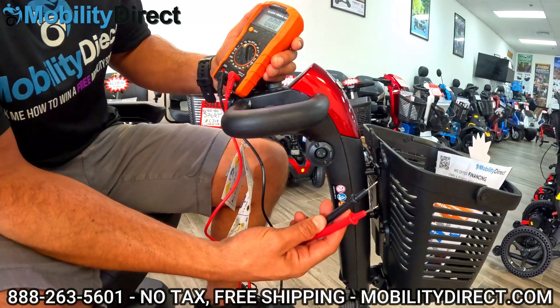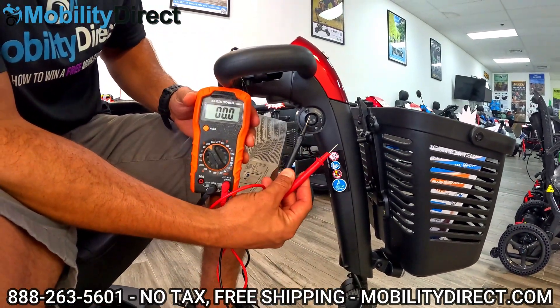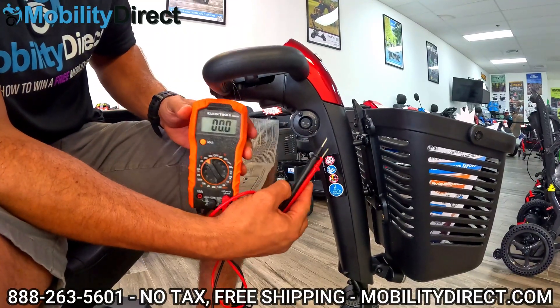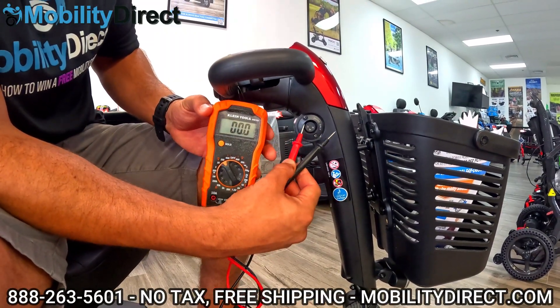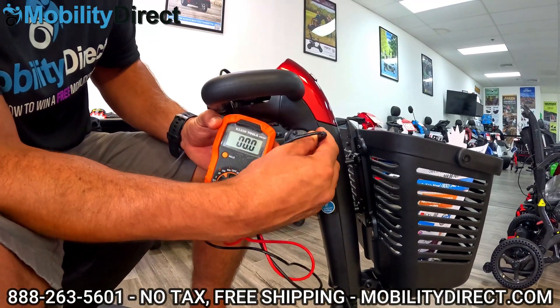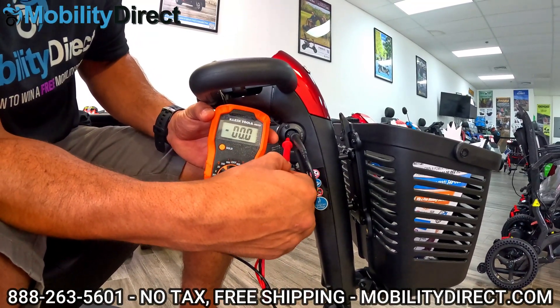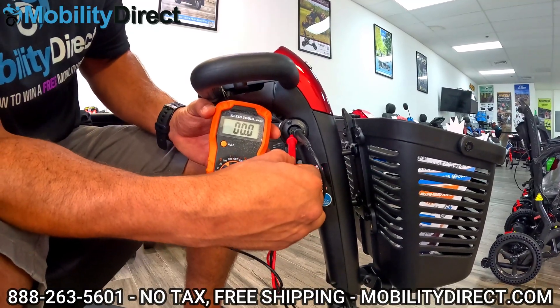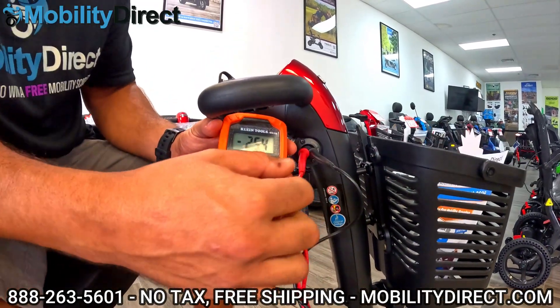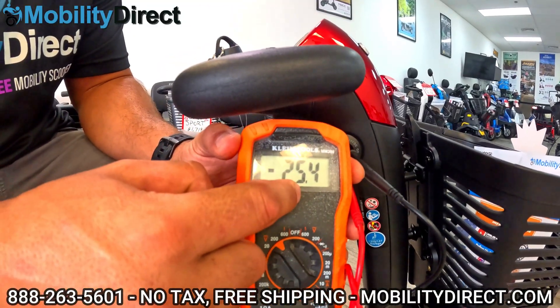Take your positive and your negative probe and you're going to want to plug one into the left and one into the right, or vice versa. Basically, you can plug them in as many ways as you want until you get a reading on your voltage meter display. I usually just go one on the right, one on the left. And there's your readout — you've got 25.4 volts, which is good.